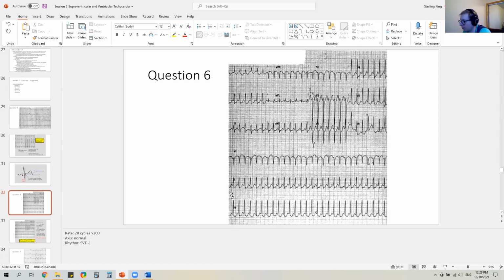we're now trying to figure out where the P waves are. If we can see P waves, then it directs us one way or another. So that looks like a T, and there's a little blip down here. So it goes QRS, and there's this blip, and then it goes up. The question is, is that right there? I mean, this is really small. It looks like there's a little blip right here. There's another one there, and there, and there. So these look like retrograde P waves, and then the T wave is going up.